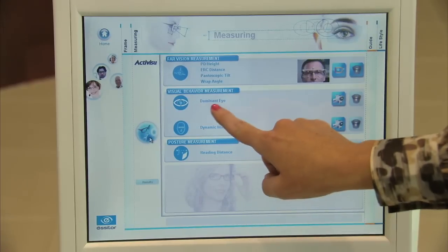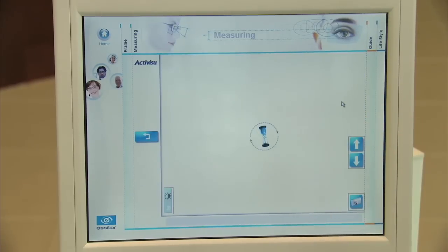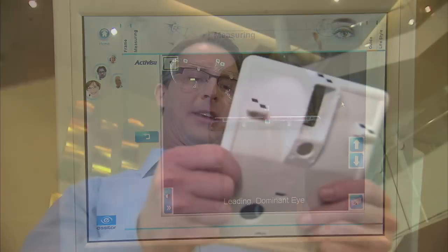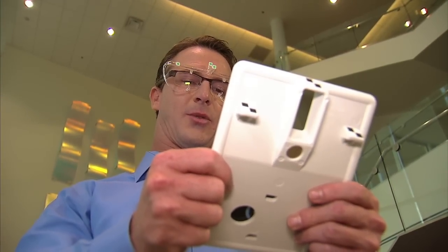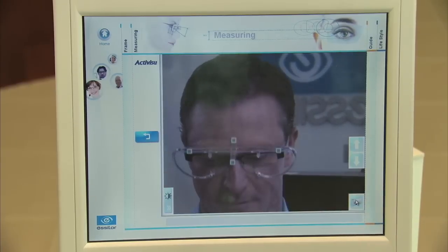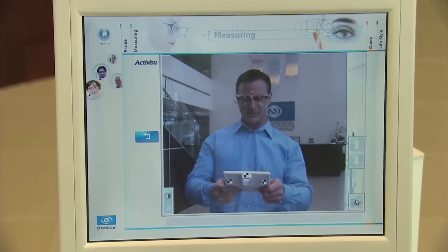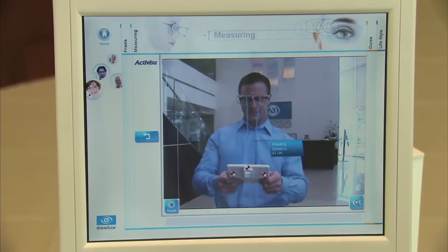The visual behavior measurements include the leading dominant eye and dynamic head-eye ratio measurements, while the posture measurement will record the patient's natural reading distance. These personalized parameters can be used to dispense the latest in premium lens designs, including the Varilux Ipsio, Varilux Eye Code, and Varilux S with 4D technology lenses.